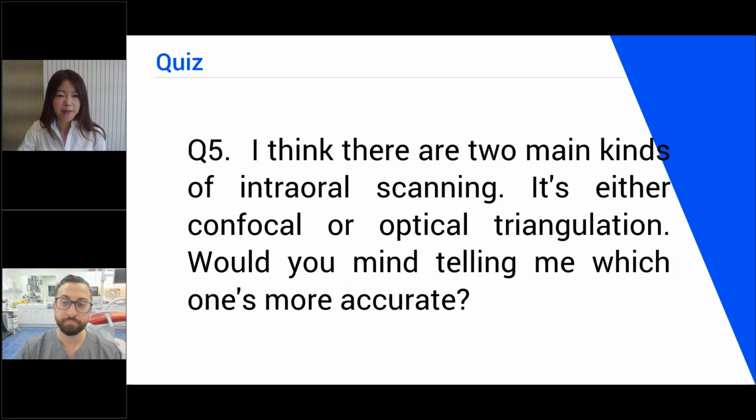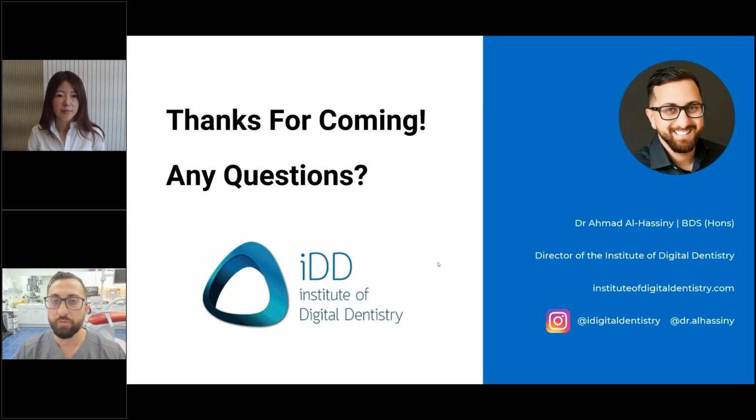Question number 5. I think there are 2 main kinds of intraoral scanner. It's either confocal or optical triangulation. Would you mind telling me which one is more accurate? There's realistically no difference between the two.